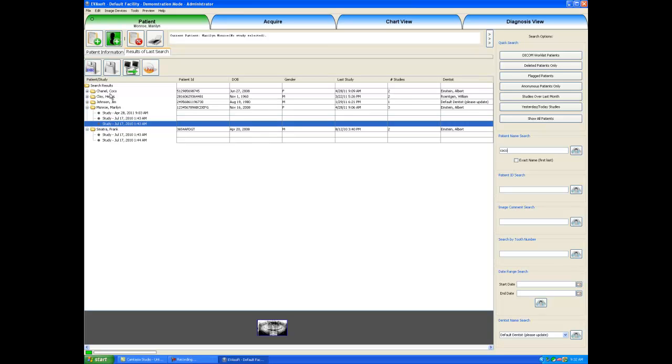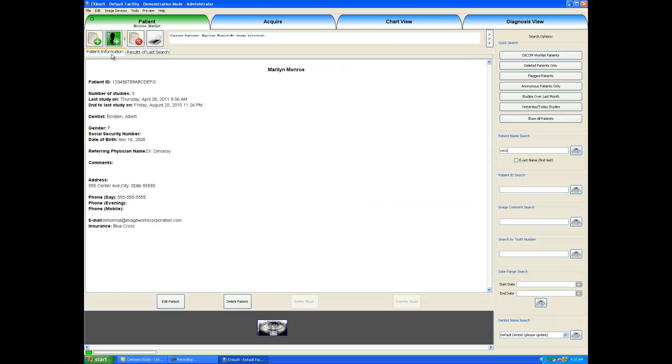Also in the patient tab, we have sub tabs. I am in Marilyn Monroe's record right now, and I can click on patient information, and this will show me the patient information that we have on Marilyn Monroe, including her gender, the dentist, the number of studies we have for Marilyn Monroe, and her address.